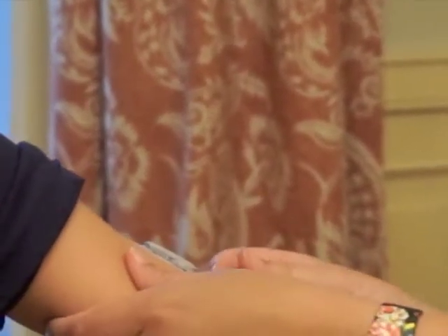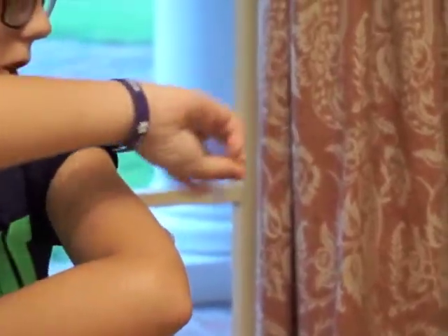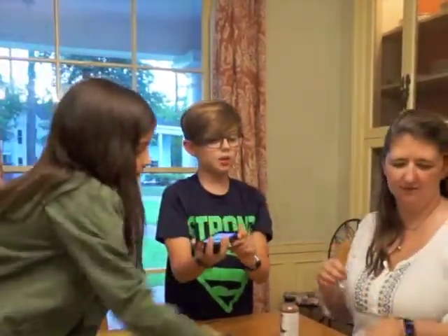Got it! So then this lever you twist off. Remember we told you to keep the key — the key is very important for taking this off. Now his phone says 'Tap to start two-hour sensor warm-up.' You tap that and it will say warm-up started, and it takes two hours to complete.